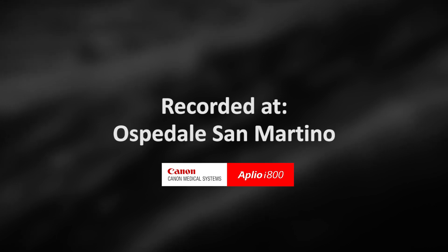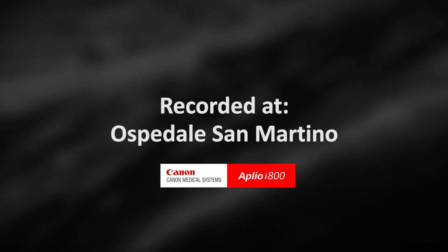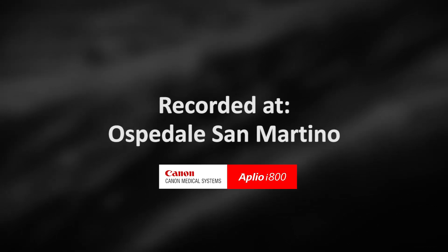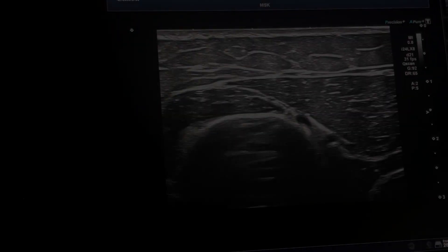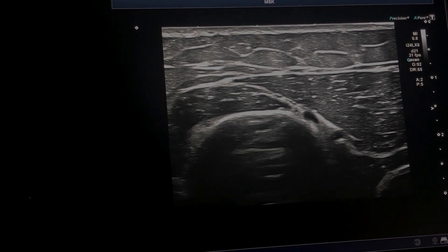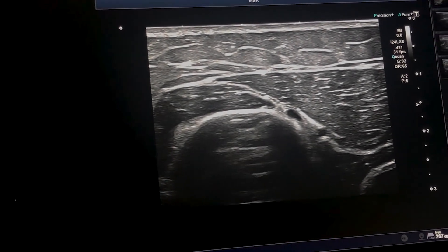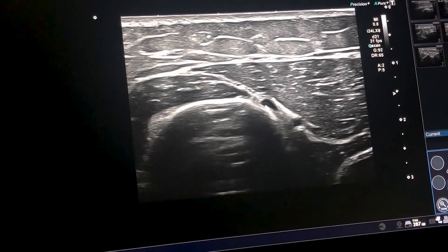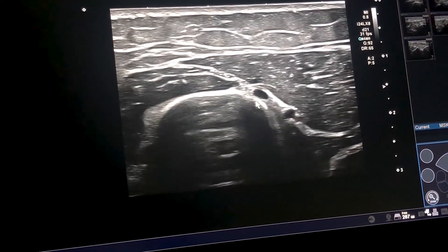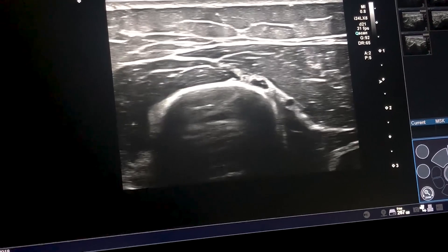To find the posterior cutaneous nerve of the arm, we have to scan the radial nerve at the level of the spiral groove.